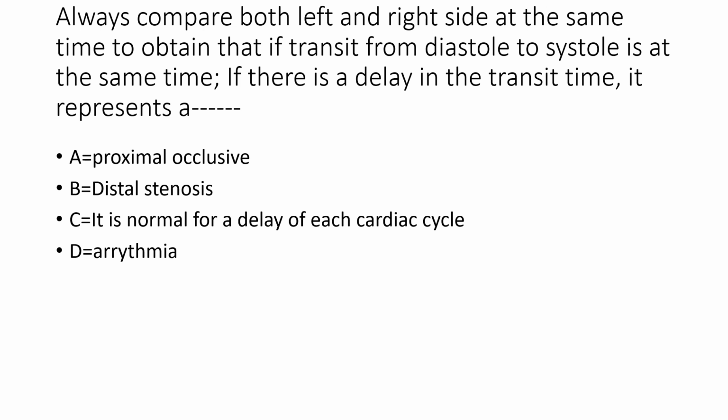If the transit from diastole to systole is at the same time, it is normal. If there is a delay in the transit time to the start of systole, it is proximal disease.